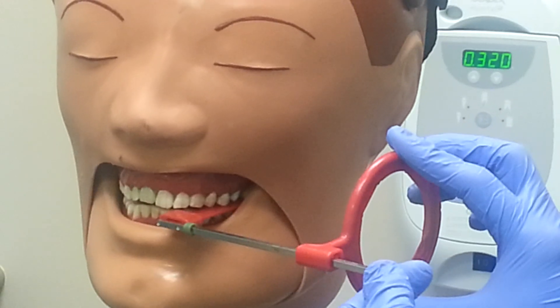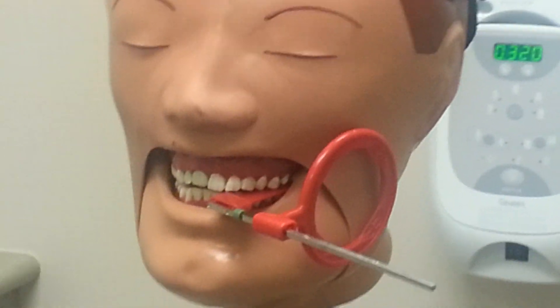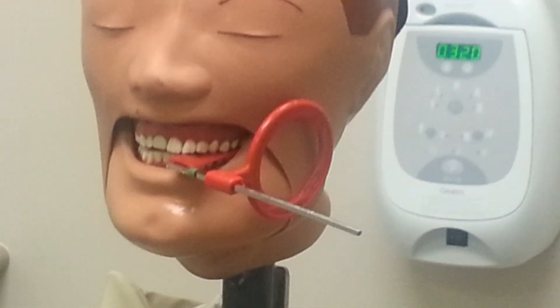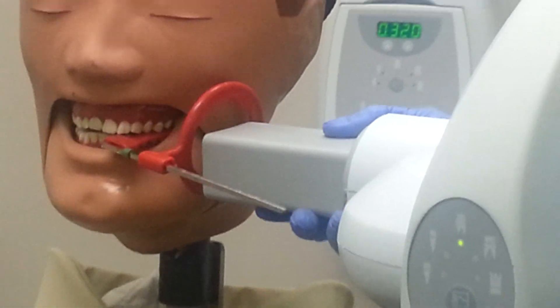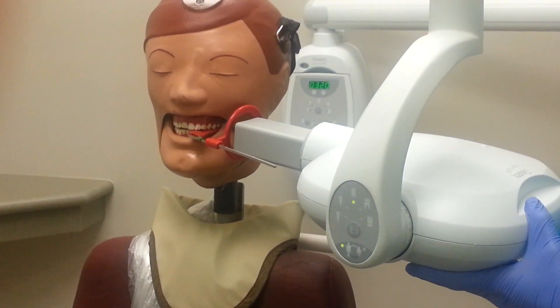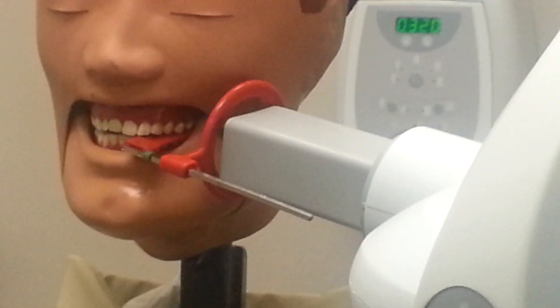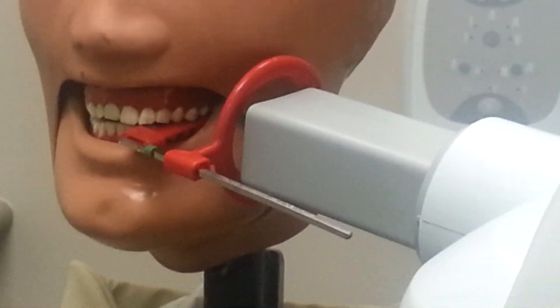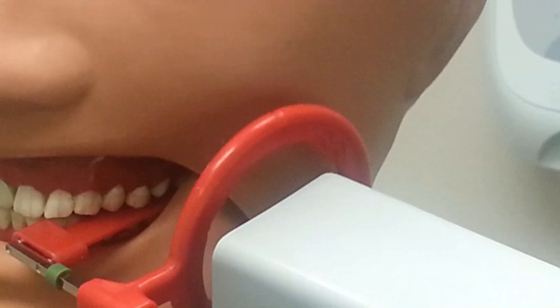Move the positioning ring forward up to the patient's face and ask them to remain still while you position the PID. A horizontal angle parallel with the contacts between the maxillary first and second molars is ideal to correctly open the necessary contacts. A vertical angle of 5 to 10 degrees should be used, or align the PID so that it is parallel with the XCP rod. Be sure the PID is set to take a horizontal image and not a vertical one. Aim it through the ring so that it lines up correctly with the horizontal marks on the ring to avoid cone cut.